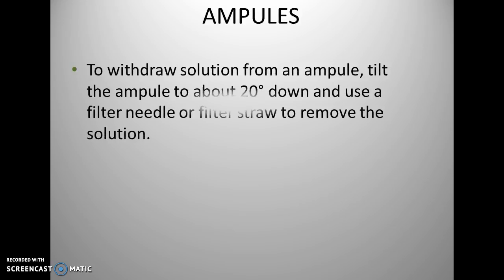Now, what are ampules? Okay, glass ampules are always broken open at the neck. So what you have here are pre-scored ampules. They have color stripes around the neck to indicate it has been weakened by the manufacturer to facilitate opening. Some ampules are not pre-scored by the manufacturer, and the neck must first be weakened or scored with a fine file. Okay.